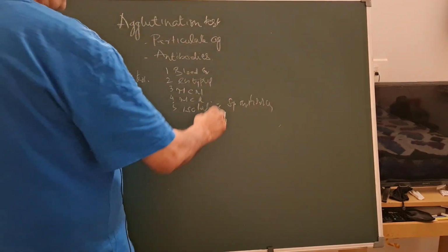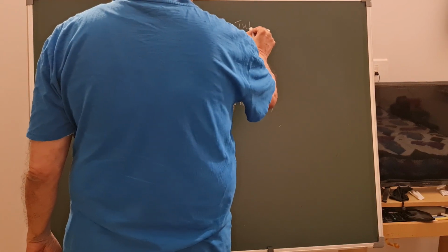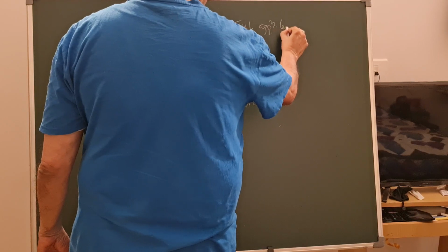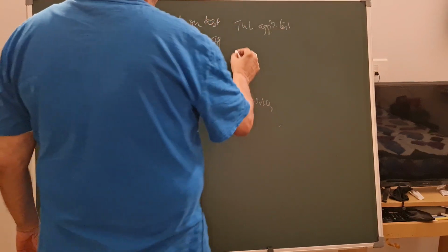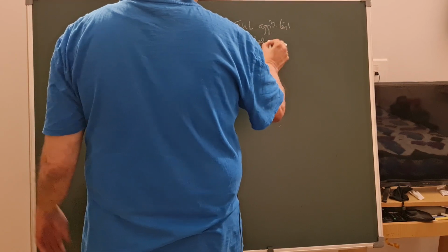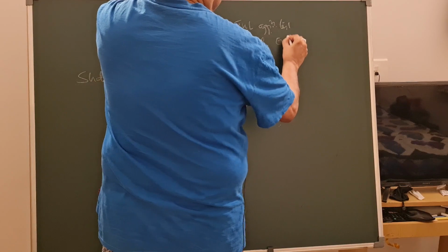Now moving on to the tube agglutination test. What are tube agglutination tests? One is Widal, done for enteric fever.